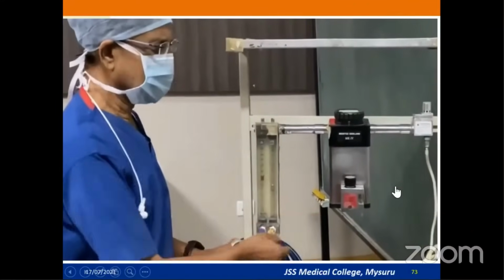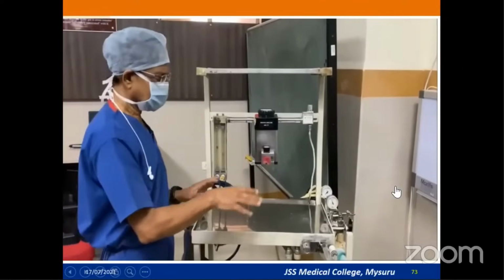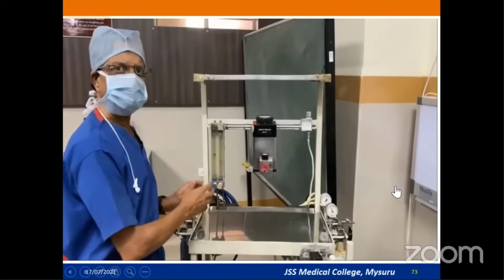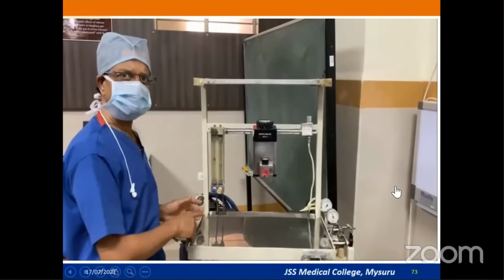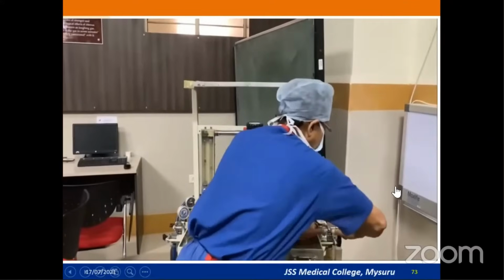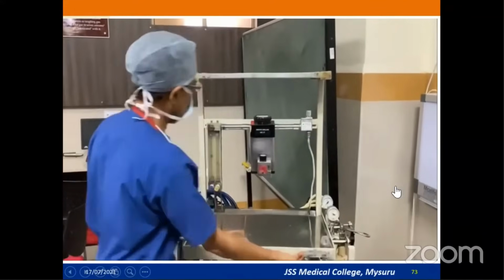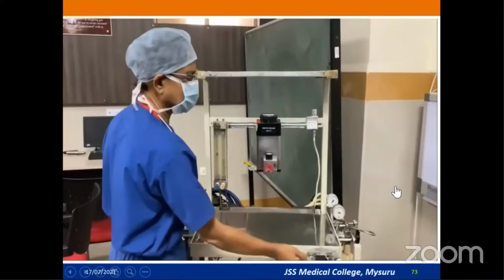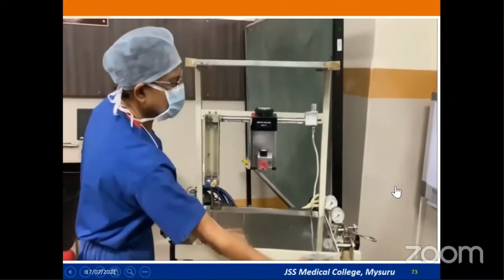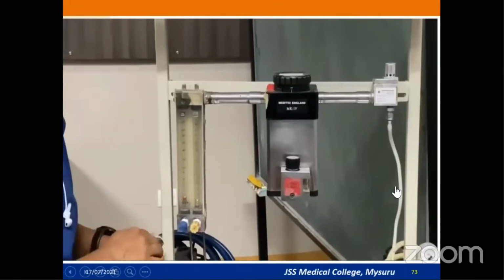So now I will close the oxygen cylinder. That means there won't be any pressure of oxygen to open up nitrous oxide, so the nitrous oxide also should fall down. I'm just closing down the cylinder of oxygen. Now there is no oxygen flow. I will remove whatever oxygen is there in the piping by pressing the flush. Now you can see nitrous oxide is also falling.